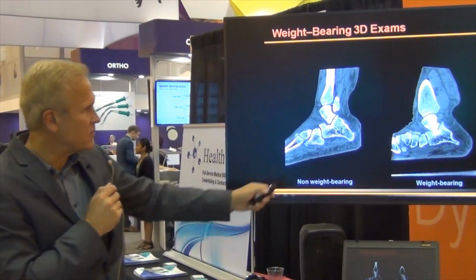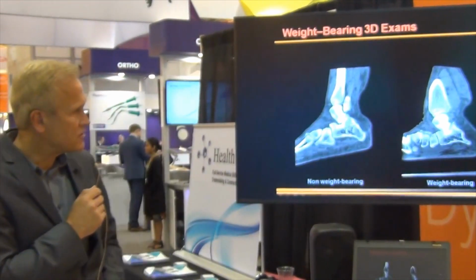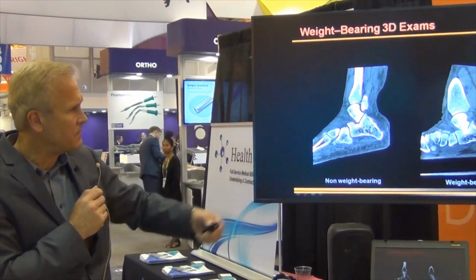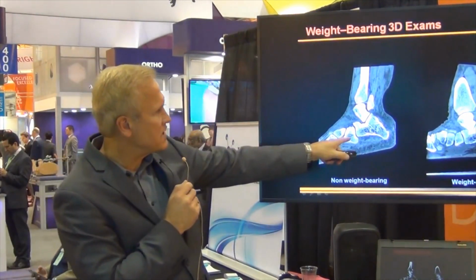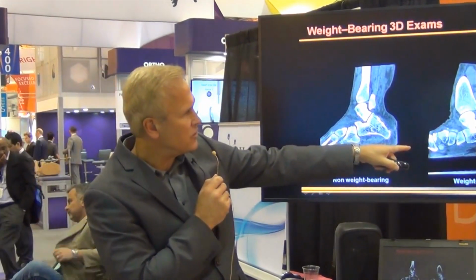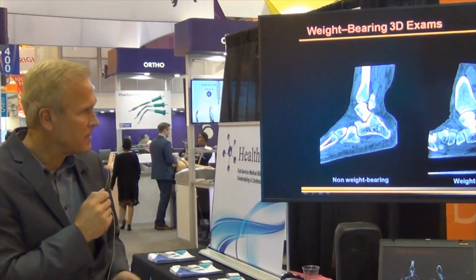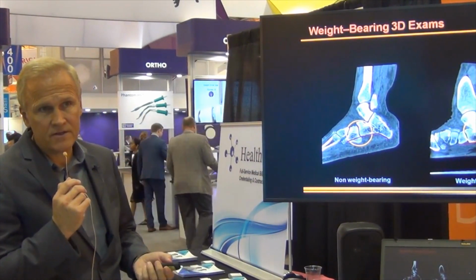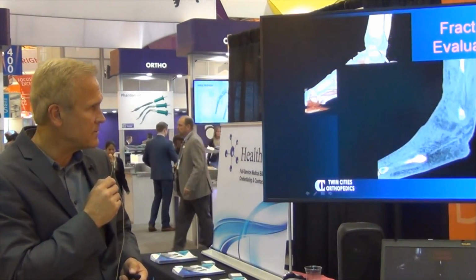Again, the weight bearing. This is another patient with actually quite a bit of ligament laxity on the plain CT scan. Non-weight bearing, you don't really see much deformity, but when they put the weight on, you can see the subluxation. The calcaneocuboid joint is quite impressive. So that's the advantage of a weight-bearing CT versus non-weight-bearing. It becomes a dynamic test.